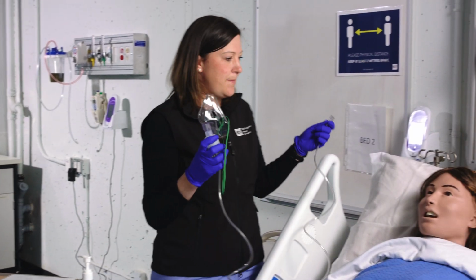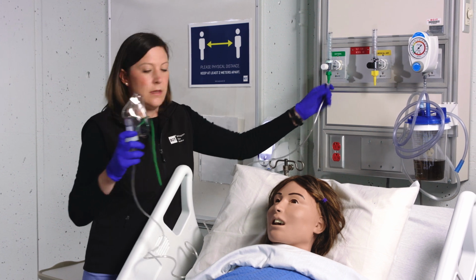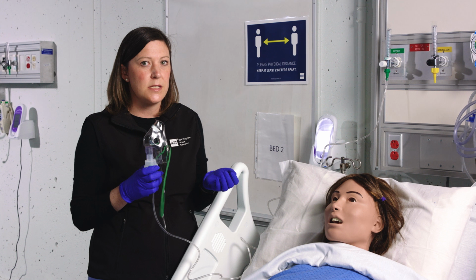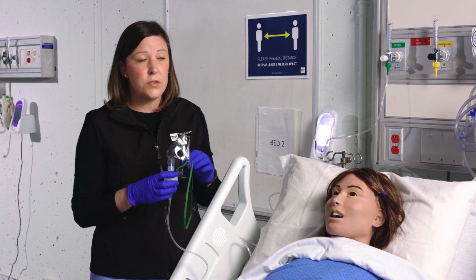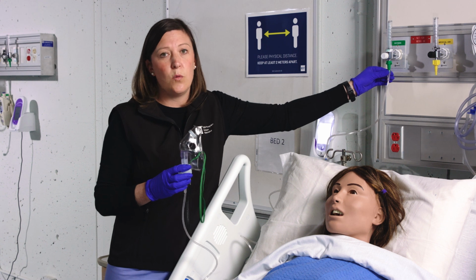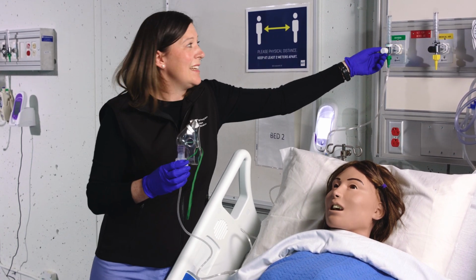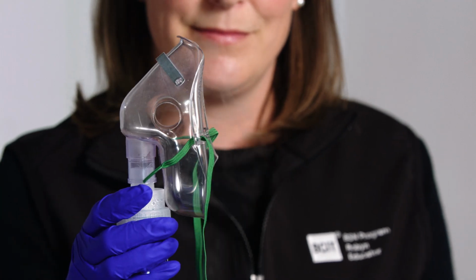Now I'm going to come over to the bedside, and I'm going to hook this up to the oxygen. You'll notice that there's also medical air here, which you may see at some hospitals. However, if your patient is requiring supplemental oxygen, it is crucial that you always administer with oxygen. I'm going to turn this up to about 6 to 10 liters. And when I do so, you're going to notice a nice mist that's coming forward.